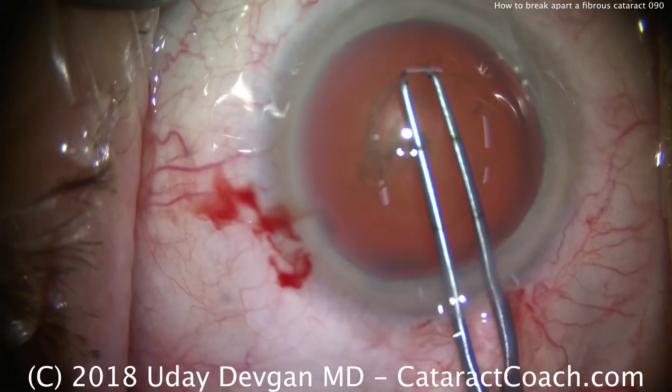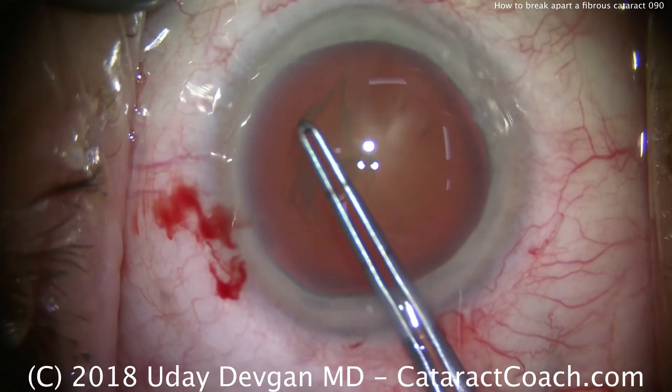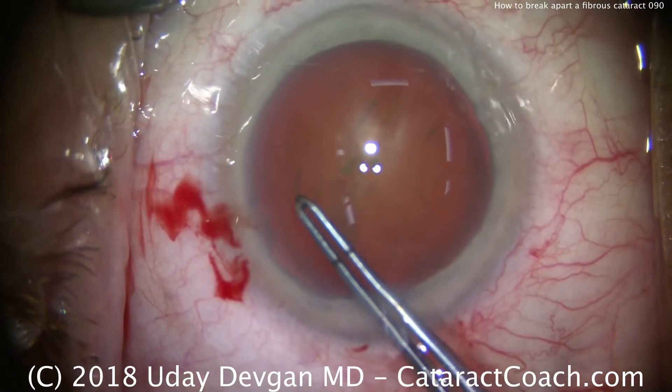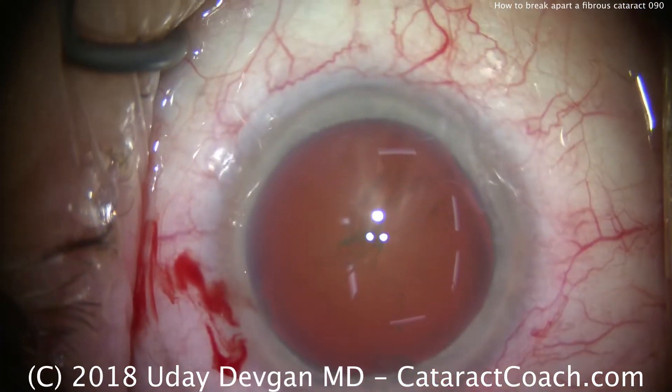And then of course during the surgery, during the rexis creation, I can go ahead and re-gauge that size. So there's the complete rexis — that's about five to five and a half millimeters in diameter.